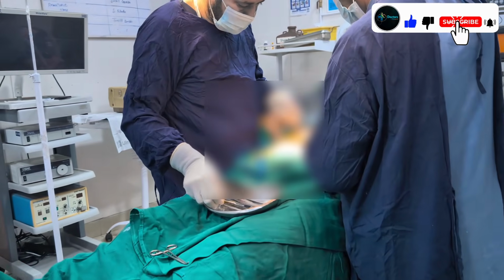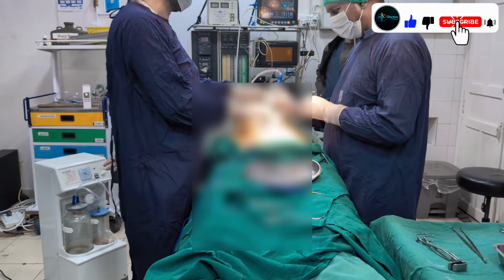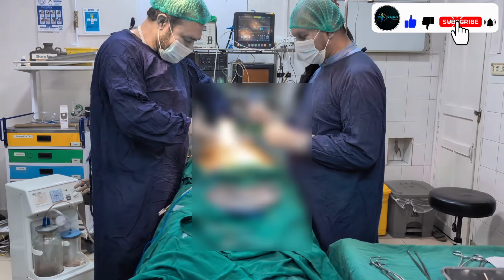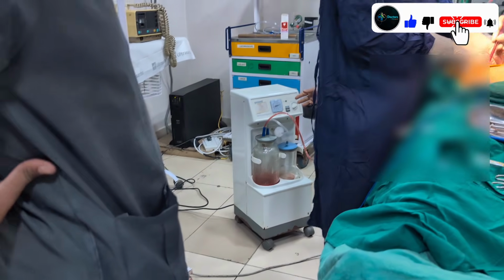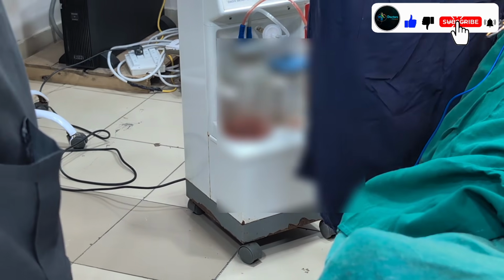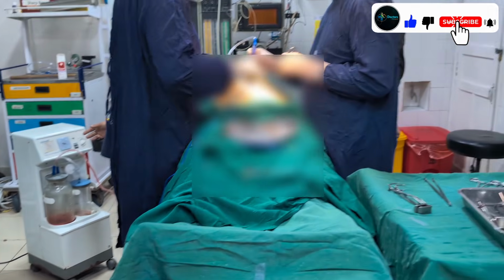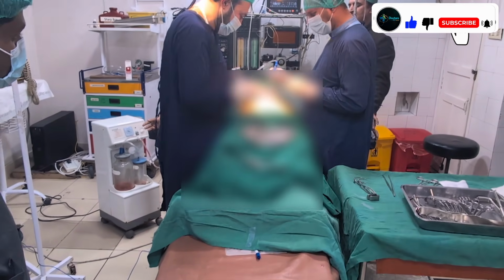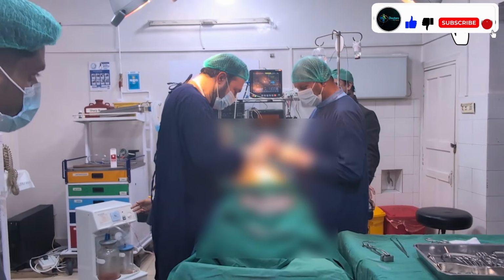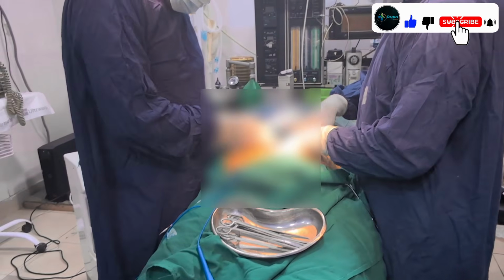This is our operating theater. The anesthesia doctor is standing in front, controlling the patient, monitoring step by step and managing anesthesia. The infusion is running, and fluid and medicine maintenance are all part of anesthesia care. The surgeon is trying his best to control bleeding so that no complication occurs. This is the suction machine. Any fluid coming out from the abdomen will be collected here. The suction is being used to remove extra fluid from inside the abdomen.